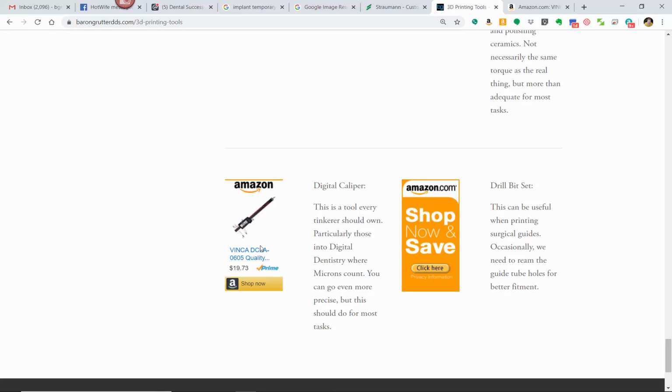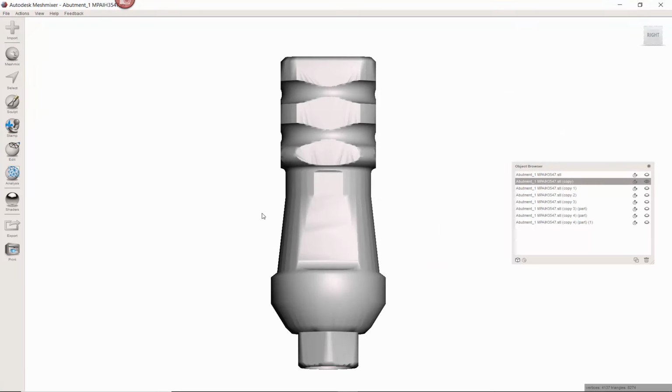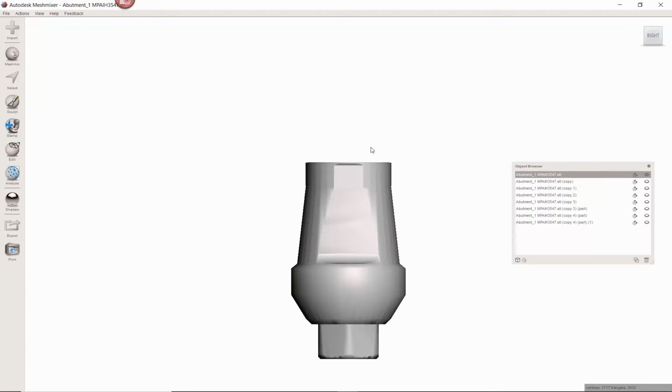So in this case, what we're going to be doing is we're going to be taking this abutment in our hands and measuring it, the diameter at a few particular areas, and the heights, okay? So a couple things I'm going to show you is I've already pre-worked this up because I don't want you to have to watch me get this ready. And so what I've done with it is I have lopped off the top of it because this is, I don't know if you're familiar with this.